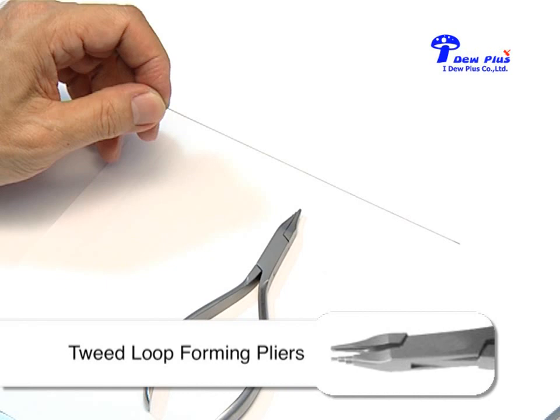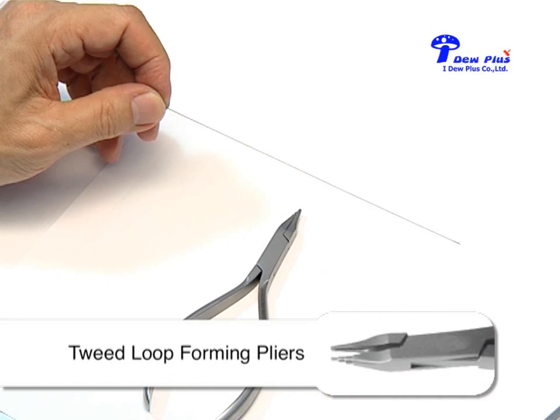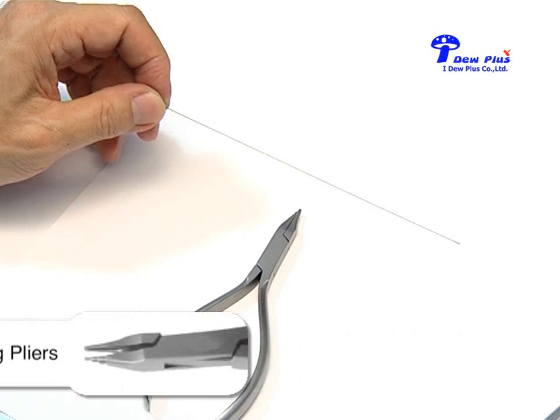The loop configuration: the size is 2 to 3 millimeter with 40 to 45 degree angulation towards mesially, 30 degrees angulation away from the gingival tissue. 0 to 25 degrees of tip back bends will be added at the end.